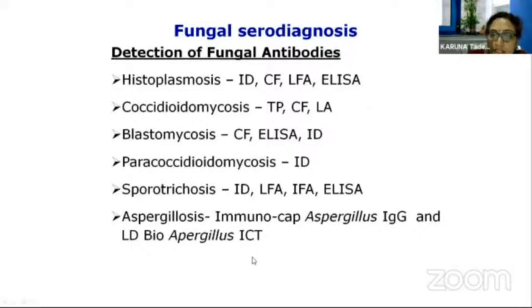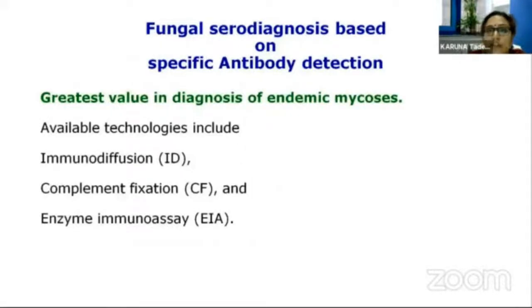But there are other alternatives which are better, and they just need to be validated in our country. Some centers are in the process of validating the LD Bio kit, which is an ICT based technique. So these are some of the antibody based techniques which we'll be discussing nicely and in detail as we progress with the presentation.